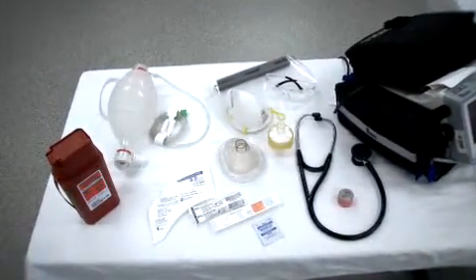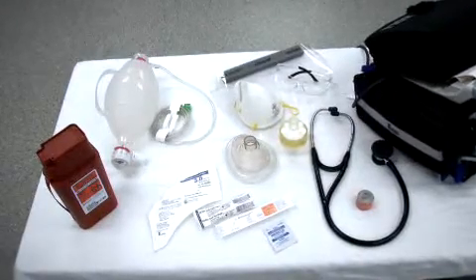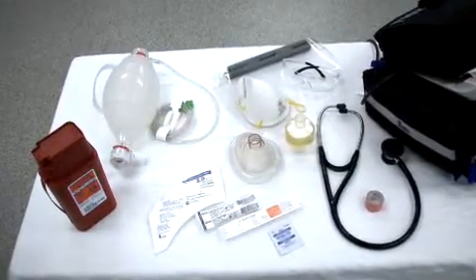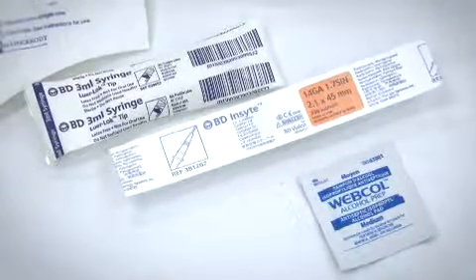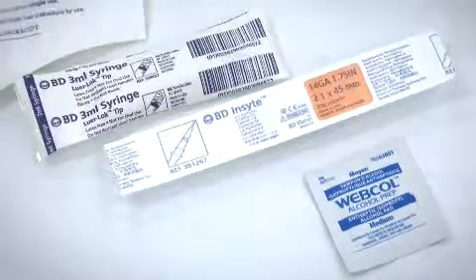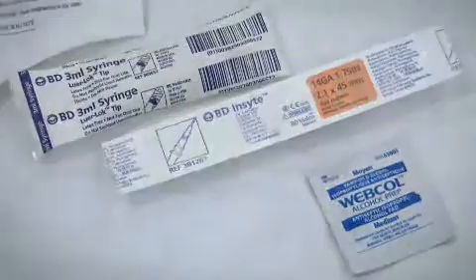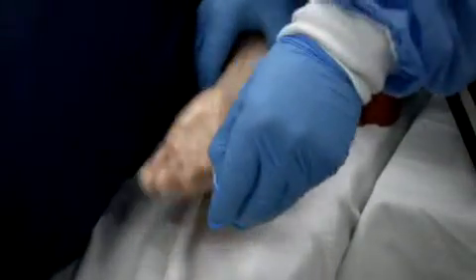Like all treatment skills, prepare all of your equipment in advance. This includes a biohazardous sharps container, appropriate personal protective equipment, bag valve mask and filter, a 3.0 or 3.5 millimeter ETT, a 3 cc syringe, a 14 gauge 1.75 inch needle over catheter, alcohol swabs, and tape. A cardiac monitor with end-tidal CO2 capabilities and a stethoscope is also required for placement confirmation and ongoing monitoring.